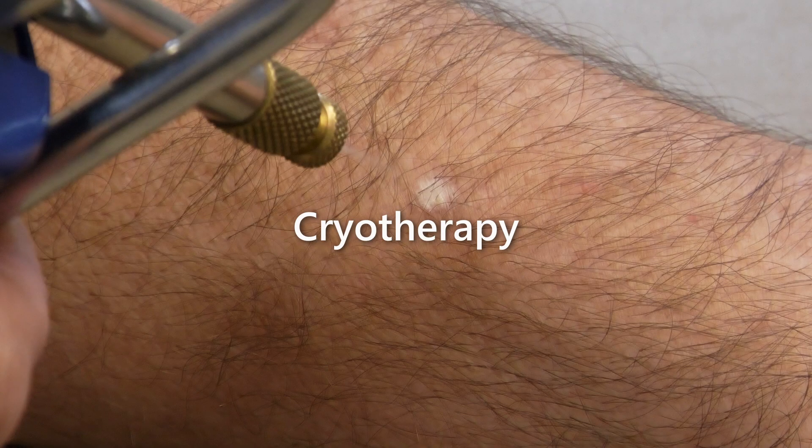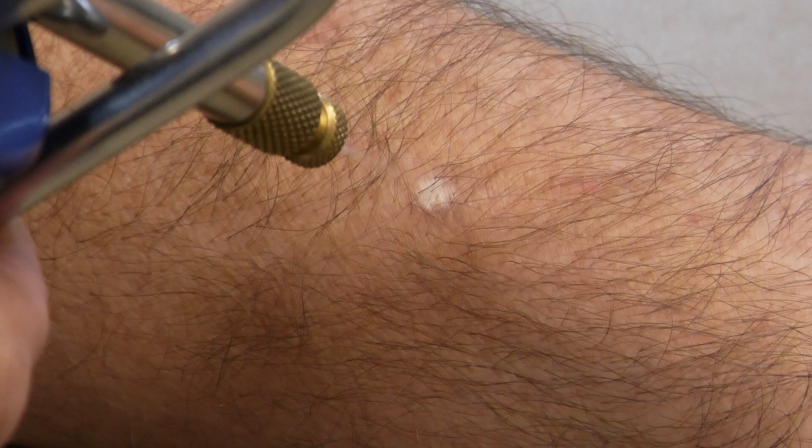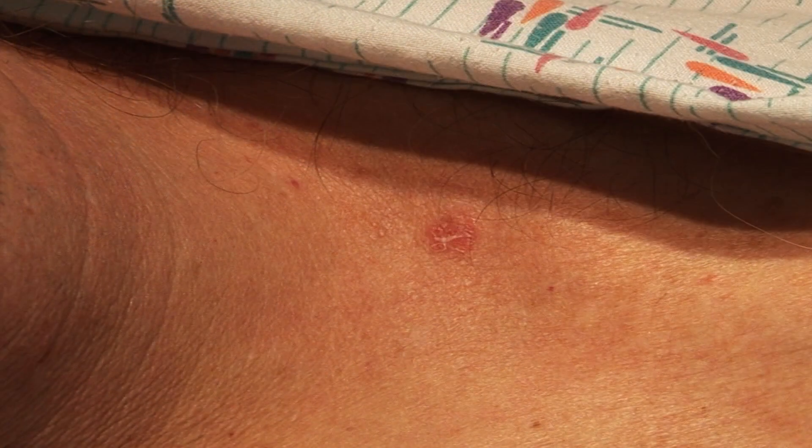Cryotherapy is a rapid and effective treatment to remove a variety of skin lesions including common warts, seborrheic keratoses, and actinic keratoses. Small basal cell cancers can also be removed and treated with cryotherapy using a cryogun, but require follow-up to ensure eradication of the tumor.